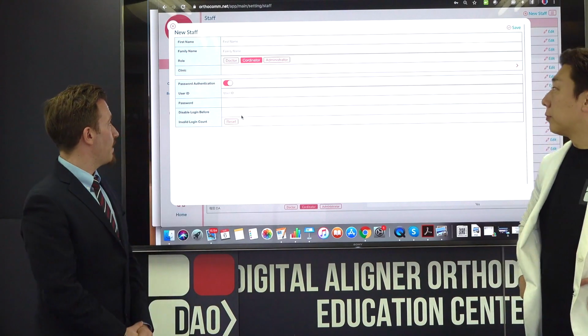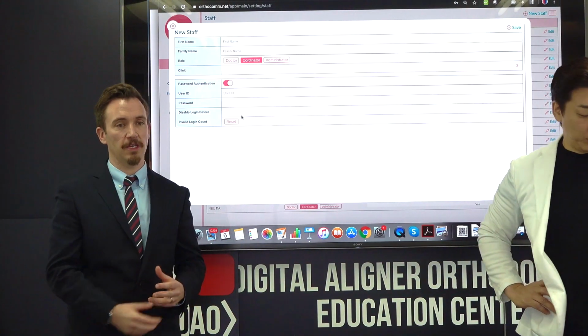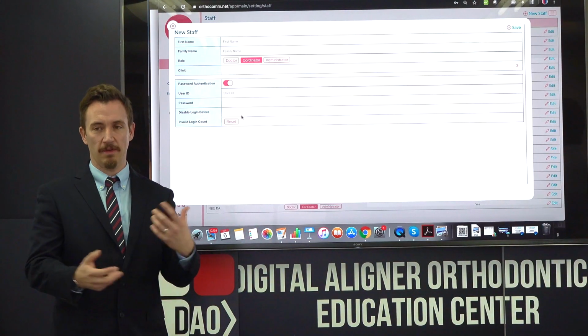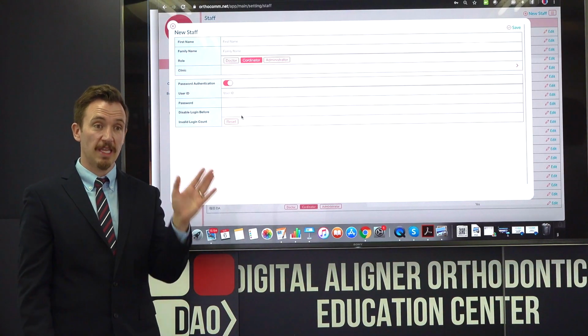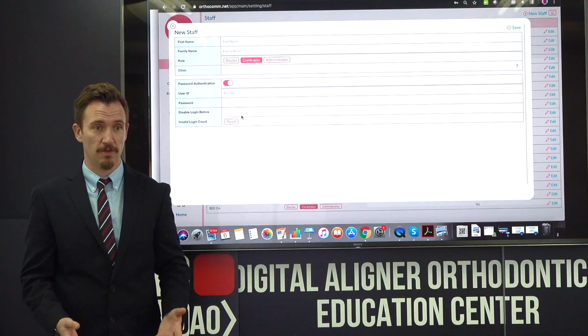Yes. So at Dr. Ojima's clinic, while he is the primary practitioner, he does have people who stay in less important patient visits for simple checks or aligner transfers, who would just be looking at data with the patient to make sure that compliance is going well. Those staff members will have access to this account, so they have access to those photos.